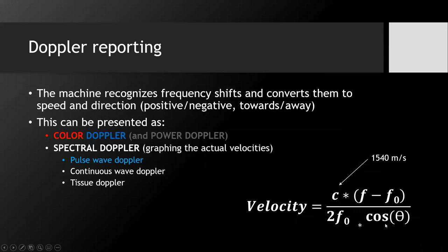It would deflate it. I have to think this through now, but if your angle is high, the cosine would be lower, your velocity would be higher, but that might, for calculus reasons, maybe I'm wrong, still make your integral lower. Oh, I see. Because you're still doing the VTI, it's possible your velocity would be higher based on this equation. I'm not a calculusist, but it must be that your integral will still end up being lower. Got it, because for the same time, you'd be covering more distance. Okay. I could be wrong about that. I also have to think about it.